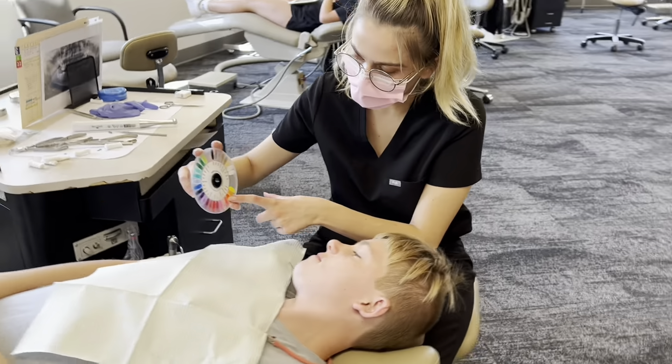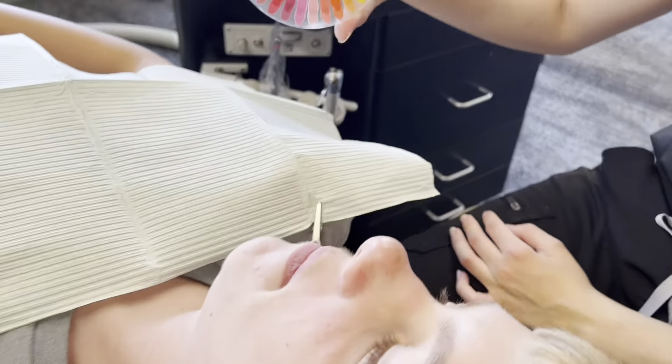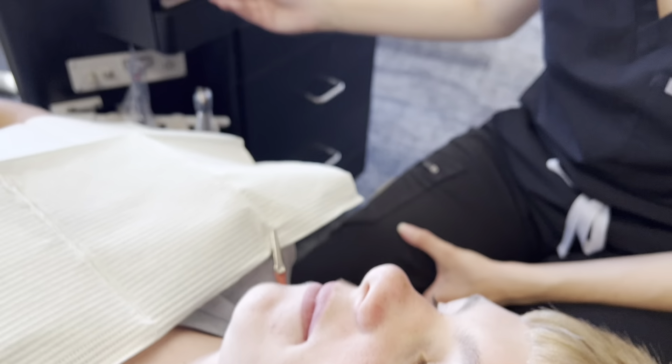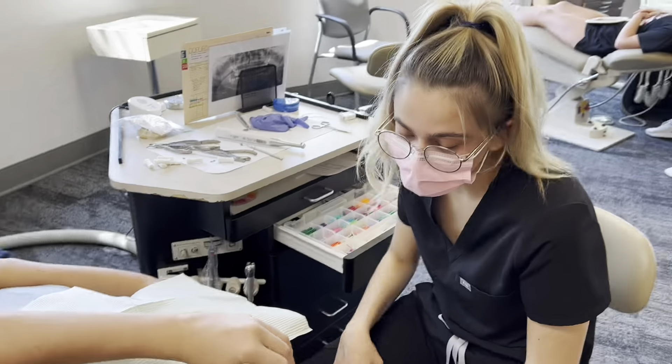You want the dark orange and just normal blue? Sure. All right, you're doing what color? Orange and blue. Orange and blue? Mm-hmm. All right, interesting. What color do you want that chain to be?